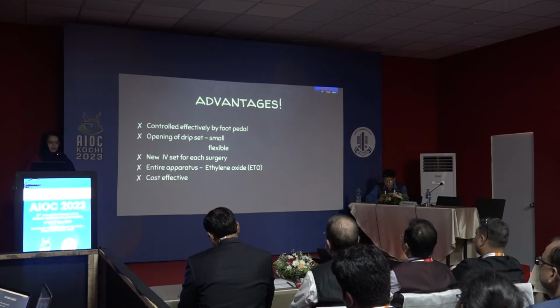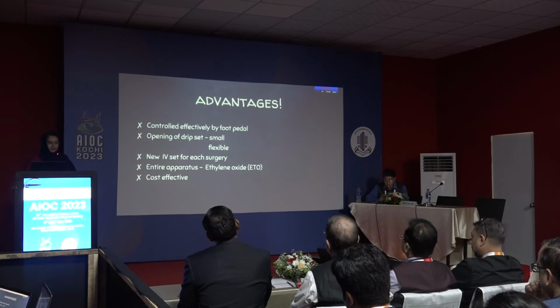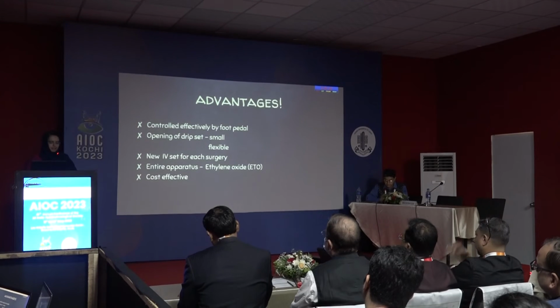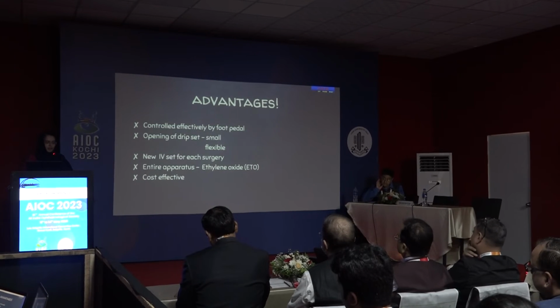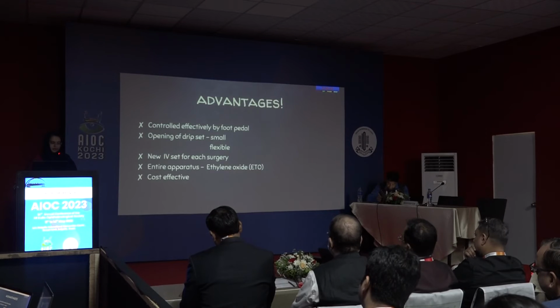So the advantages are the surgeon can control the aspiration effectively by the foot pedal as and when required, unlike the standard aspiration tool, which is permanently on all the time. And the opening at the end of the drip set is very small and flexible, which can be easily maneuvered. And a new IV set can be used for each surgery, which may avoid sterilization of the whole apparatus for each patient, and also avoid cross infection.